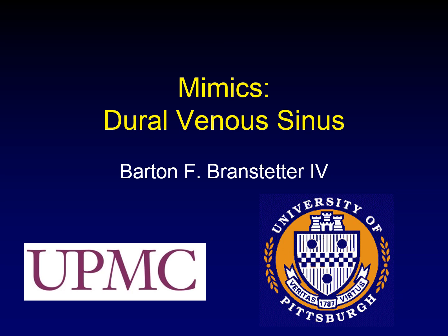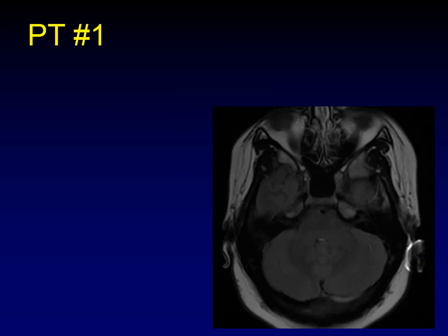For our series on MIMICS, let's look at a couple of patients who both have disease in their dural venous sinuses. This is patient number one. This is just a FLAIR sequence, but there's something wrong back here — there's abnormal increased signal right along the transverse sinus.